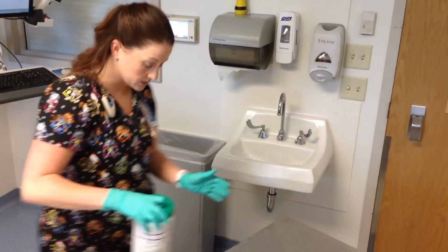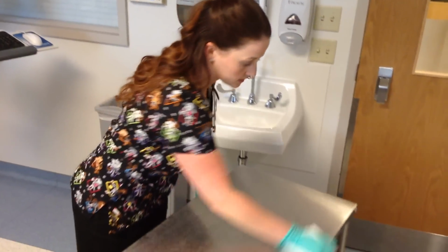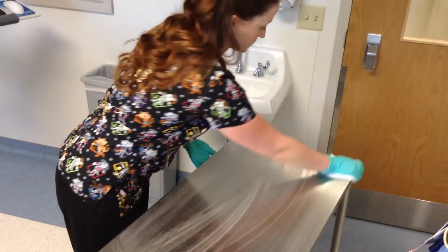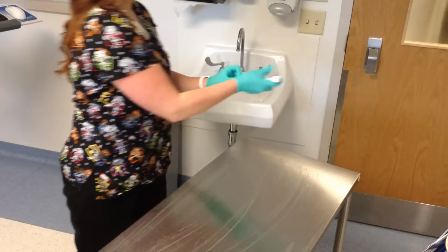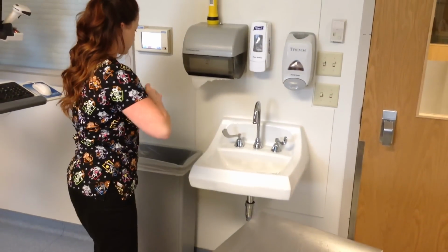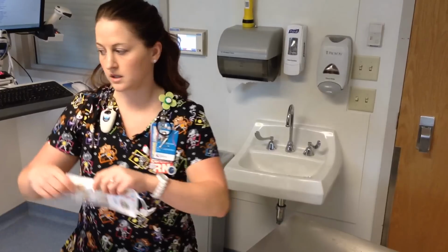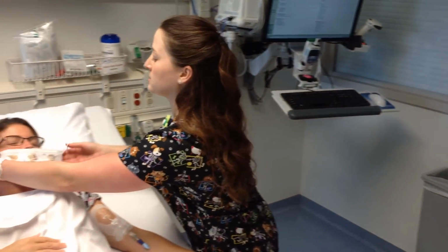The hamper should not be used, the bed should not be used. It should only be a clean work surface without clutter that gets fully cleaned and fully dried. Kelly's going to be my helper, so she's going to make sure everyone in the room gets masked. That includes the patient. Brianne is our lovely patient.